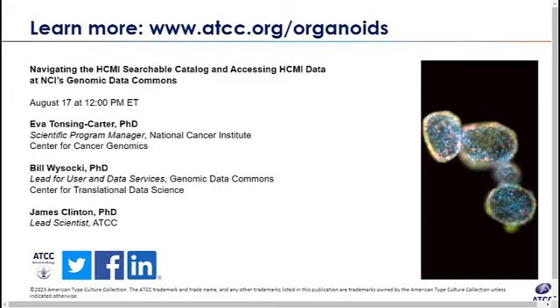Start with that. If you're seeing that the media is quickly turning very acidic, the phenol red indicator is turning bright yellow, you should probably consider changing the media more often. But start with every 2 days as a general guidance.